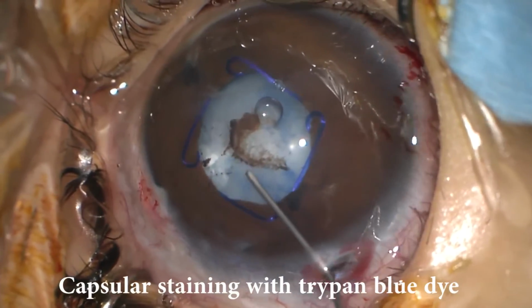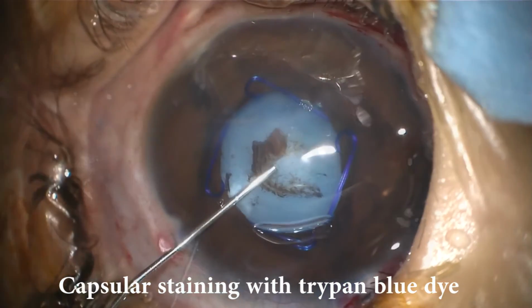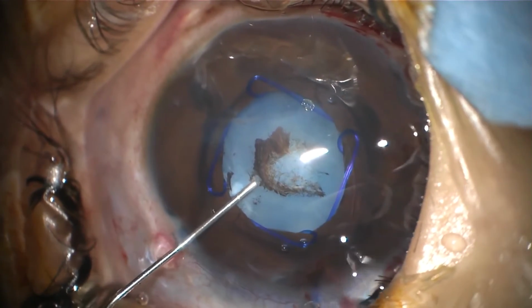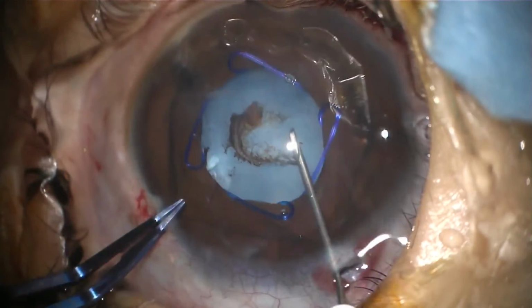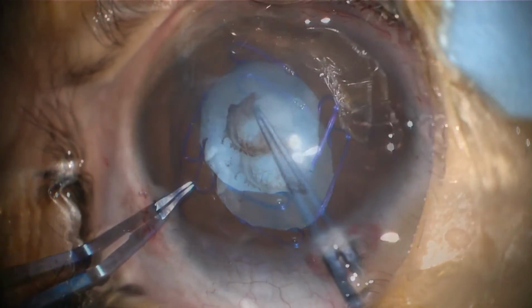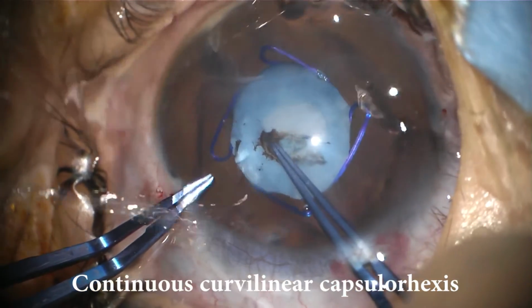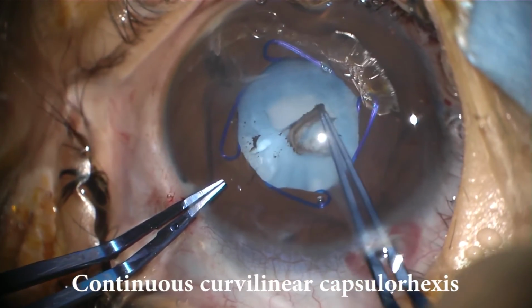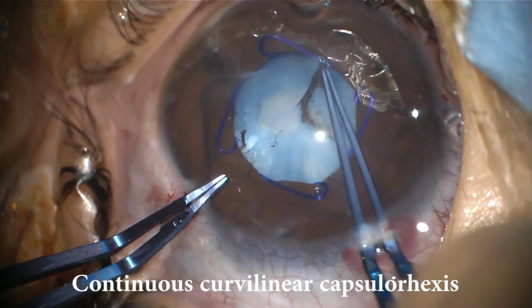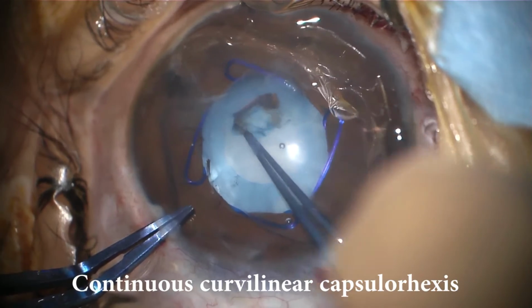The anterior capsule was stained with trypan blue dye under viscoelastic to improve visualization. A continuous curvilinear capsulorhexis was started with a needle cystitome and completed with Utrata forceps. Capsulorhexis can be particularly difficult in such cases due to the fibrotic nature of the anterior capsule.